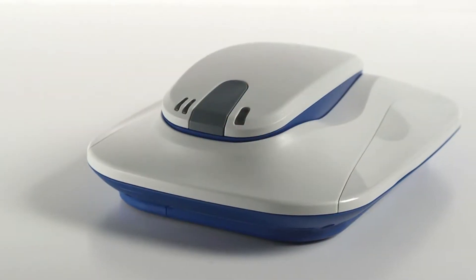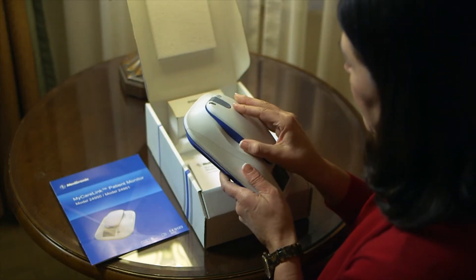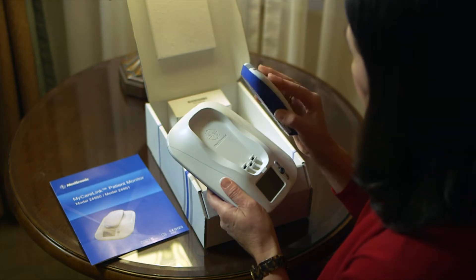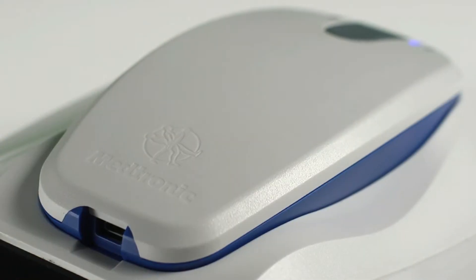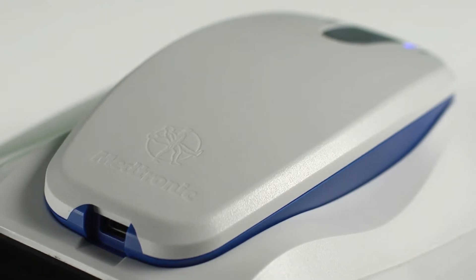The first thing you'll want to do when you get home following the insertion of the RevealLink cardiac monitor is to set up the other necessary component to the system: the MyCareLink patient monitor. Proper setup of the MyCareLink monitor is necessary for the system to work, because this is the only way to move the heart information from the RevealLink to a location where your doctor can review it. The MyCareLink monitor will keep you connected to your doctor wirelessly and automatically. Let's walk through the setup together.